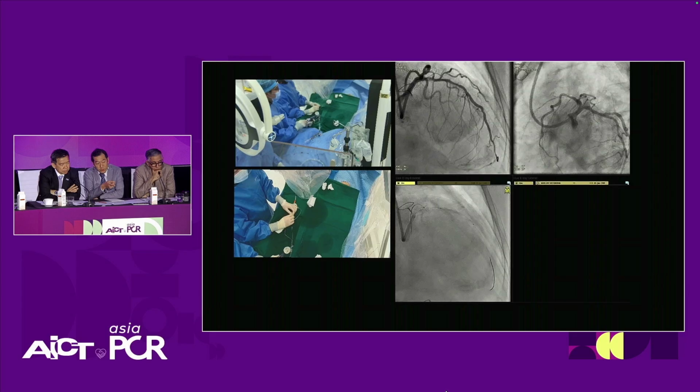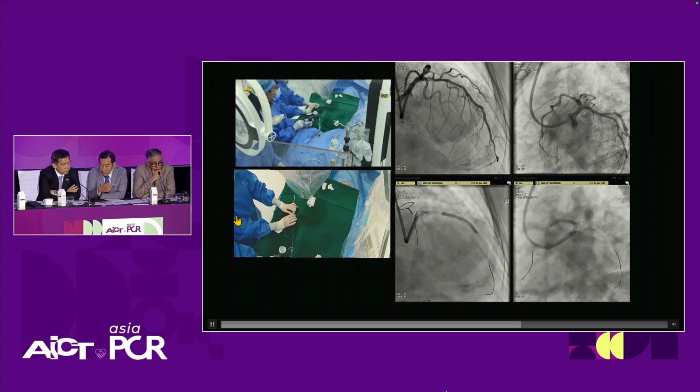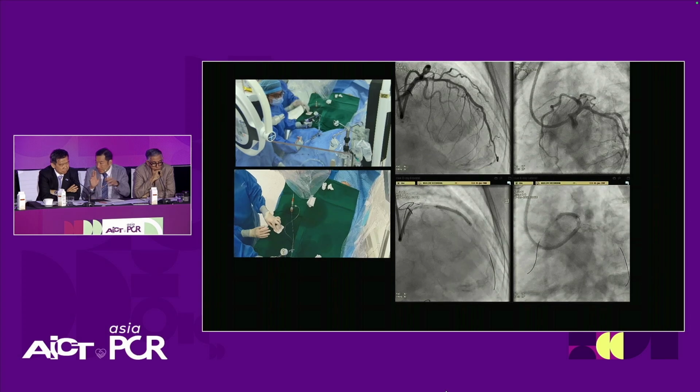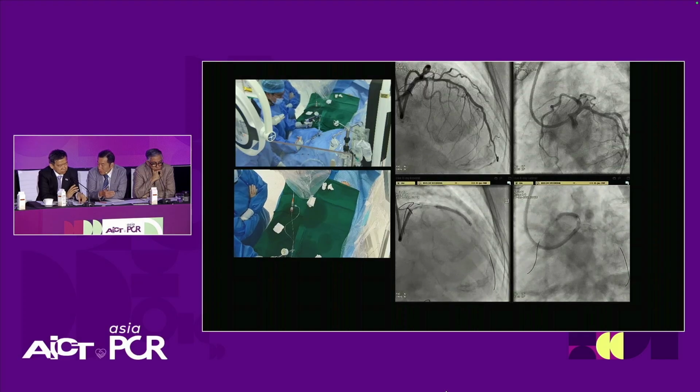So you do a lot of DCBs after in Malaysia, right? I think the reservation that a lot of people have is when they do the IVUS after lesion prep, especially if they use things like cutting balloon, etc. It looks scary, right? Scary in inverted commas. A lot of dissection planes. I think we saw the still plane there. How are you comfortable with using a DCB? And is there any point where you won't use a DCB based on IVUS findings?